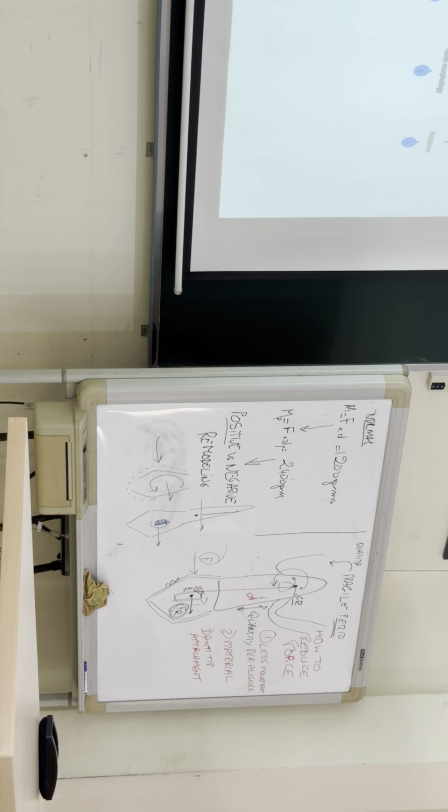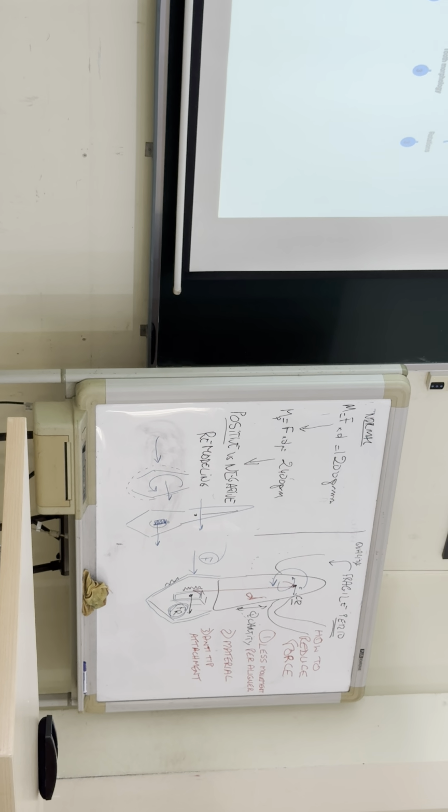So you may need a RPE, you need something before the aligner. So again, the curve of Spee is the same. You have to ask yourself, do I want to get involved in that one?